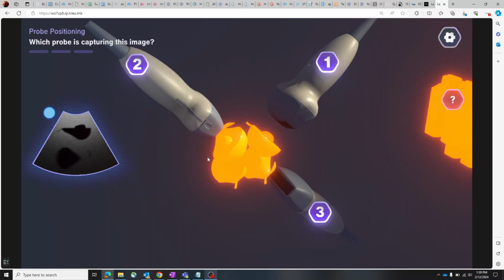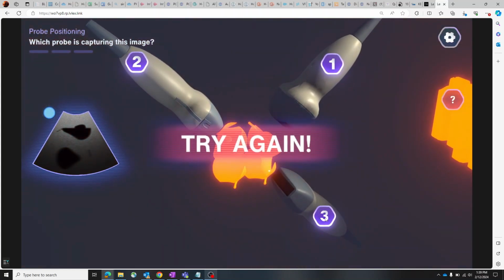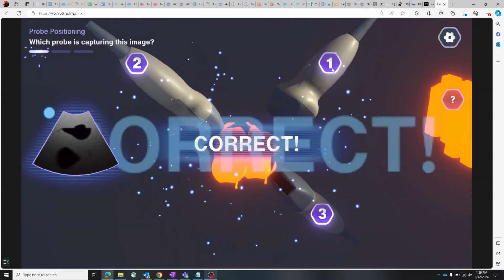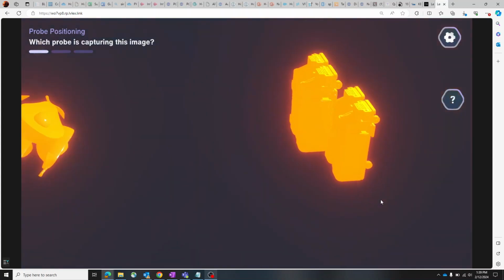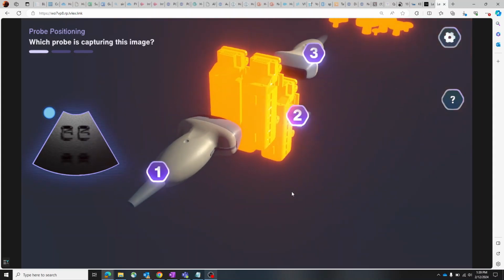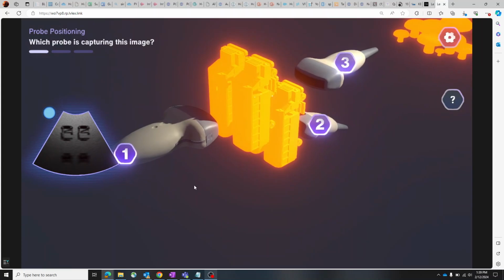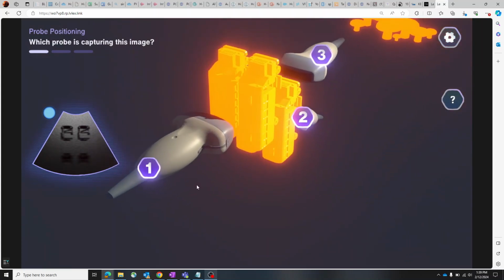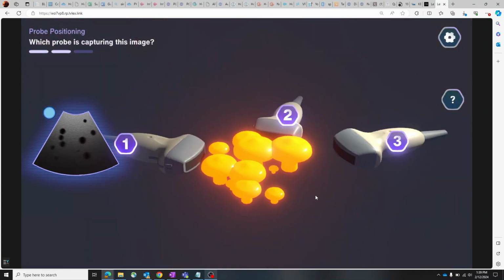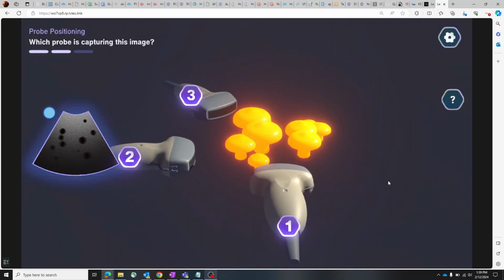And we'll touch on that a little more later too. So Ian, at the end of the module, is there a place to add some suggestions or comments? Yeah, so actually today at the end of this presentation, there will be a link. If you have comments or suggestions, we'd love to hear them. Or we have an email address you can reach out to us. We don't have it built into the game, but I would assume as part of our process of the second phase study, there would be an opportunity for the participants to provide their feedback then as well.